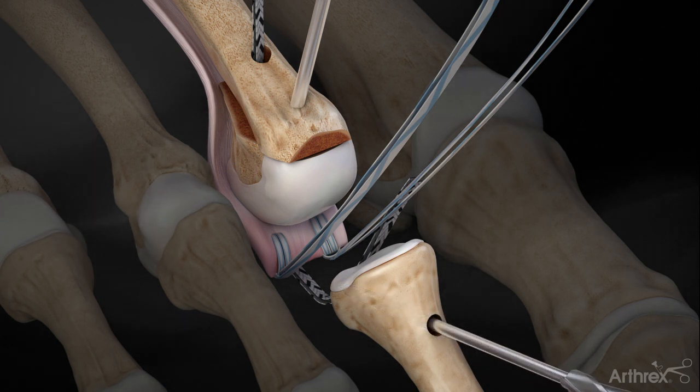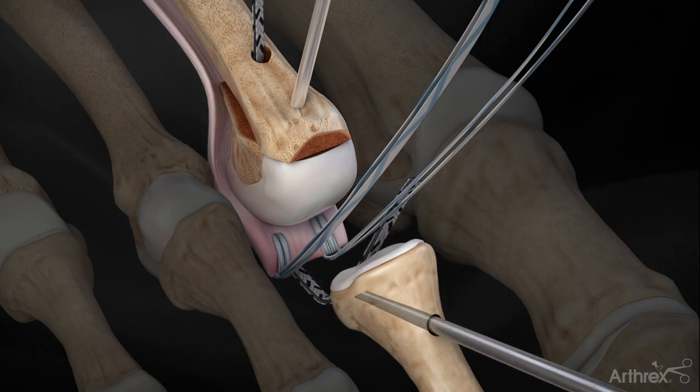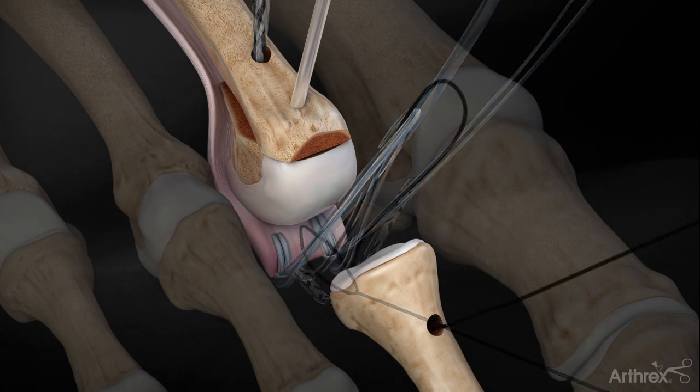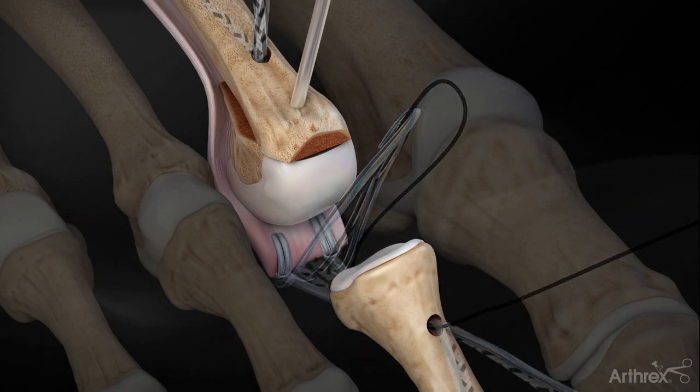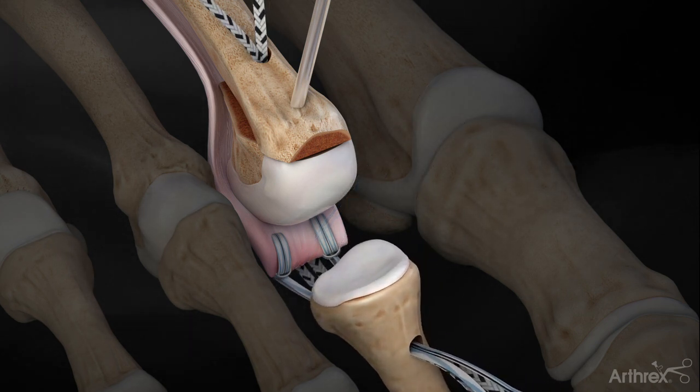Next, the 2.5 mm cannulated drill is used to create a bicortical bone tunnel over the K-wire in the proximal phalanx. Use the straight microsuture lasso to feed the lasso wire through the bone tunnel. Feed the free limbs of the labral tape and suture tapes into the lasso wire and shuttle through the bone tunnel.